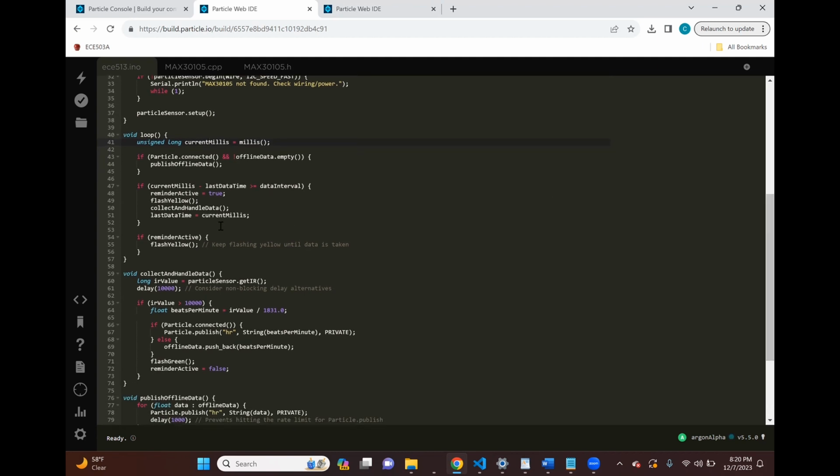One of the functions called above was to collect and handle the data, and that function is right here. This actually was given in the class activity, and the only updates to this are that after the data is taken, we flash the LED green to show the user that their measurement was a success, and then we turn off the reminder, which was the yellow flashing LED.